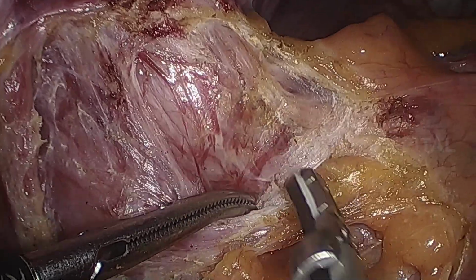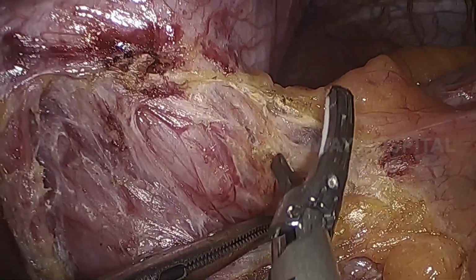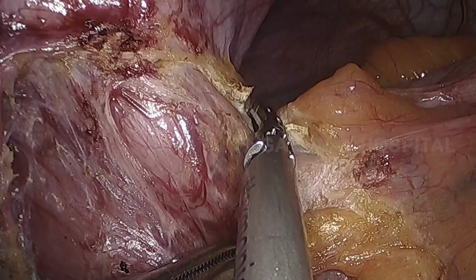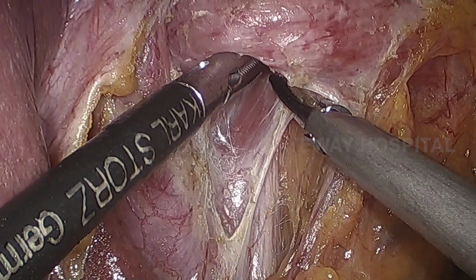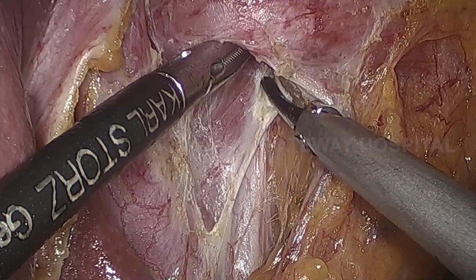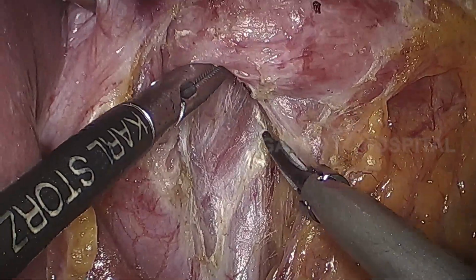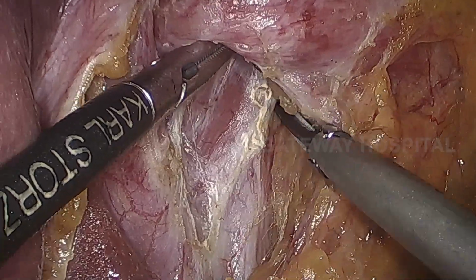While doing anterior dissection, you have to be very careful. We should not injure the anterior vagus. Similarly, while doing posterior dissection, you have to take the posterior vagus along with the esophagus in order to avoid injury to the posterior vagus.